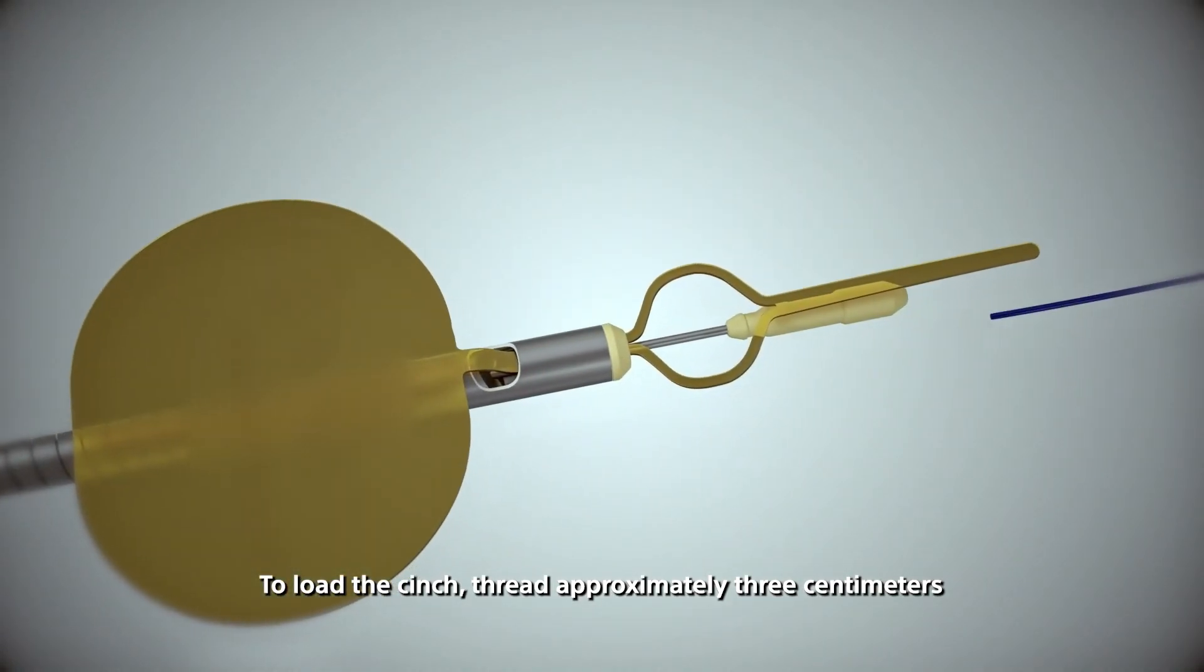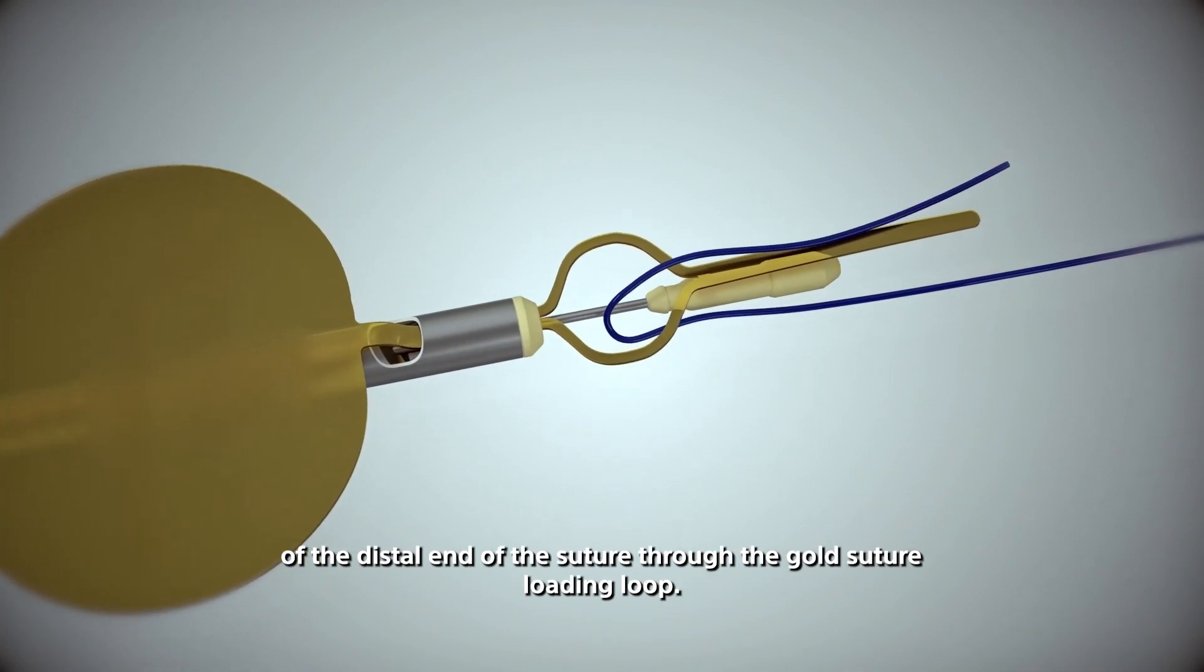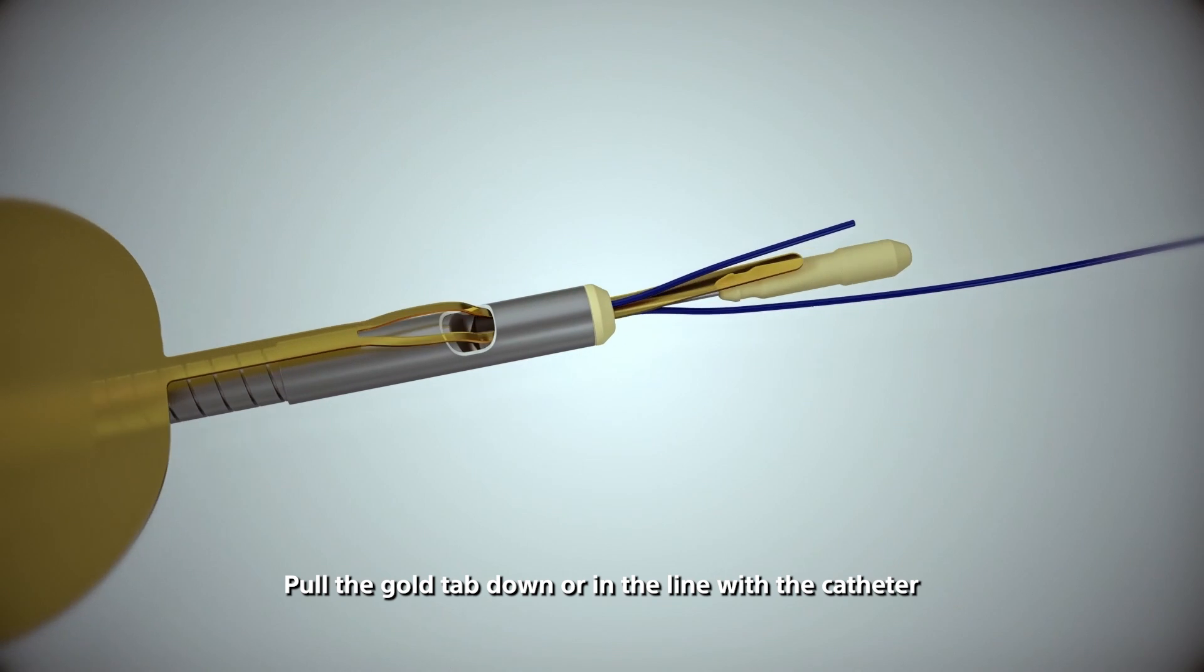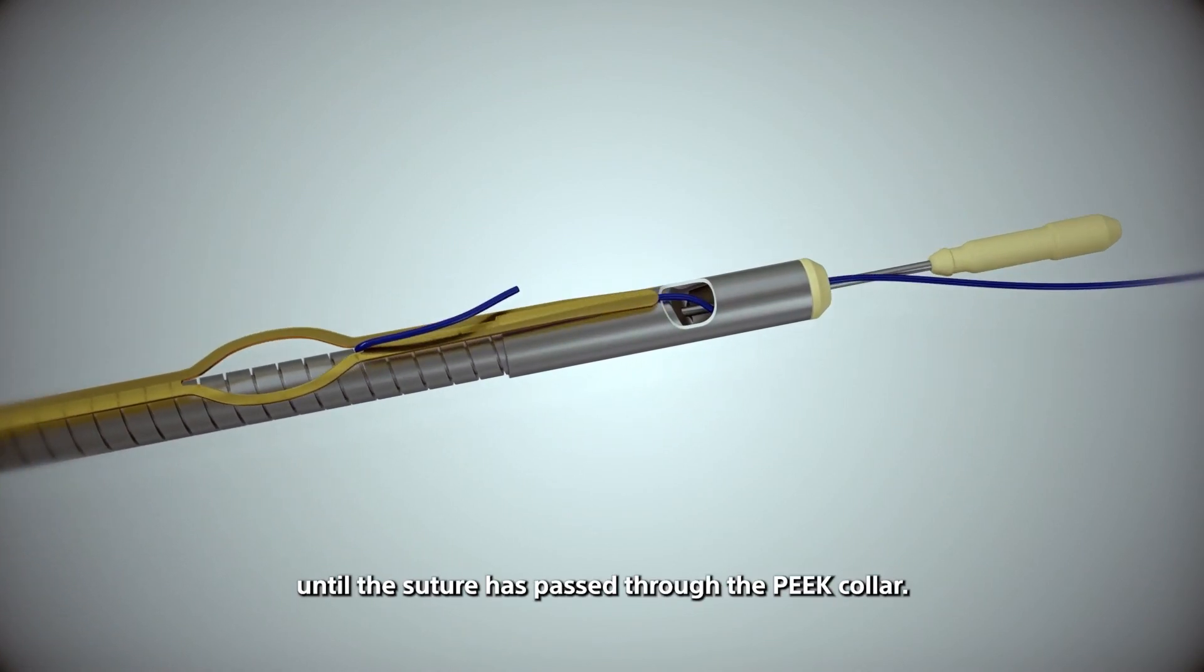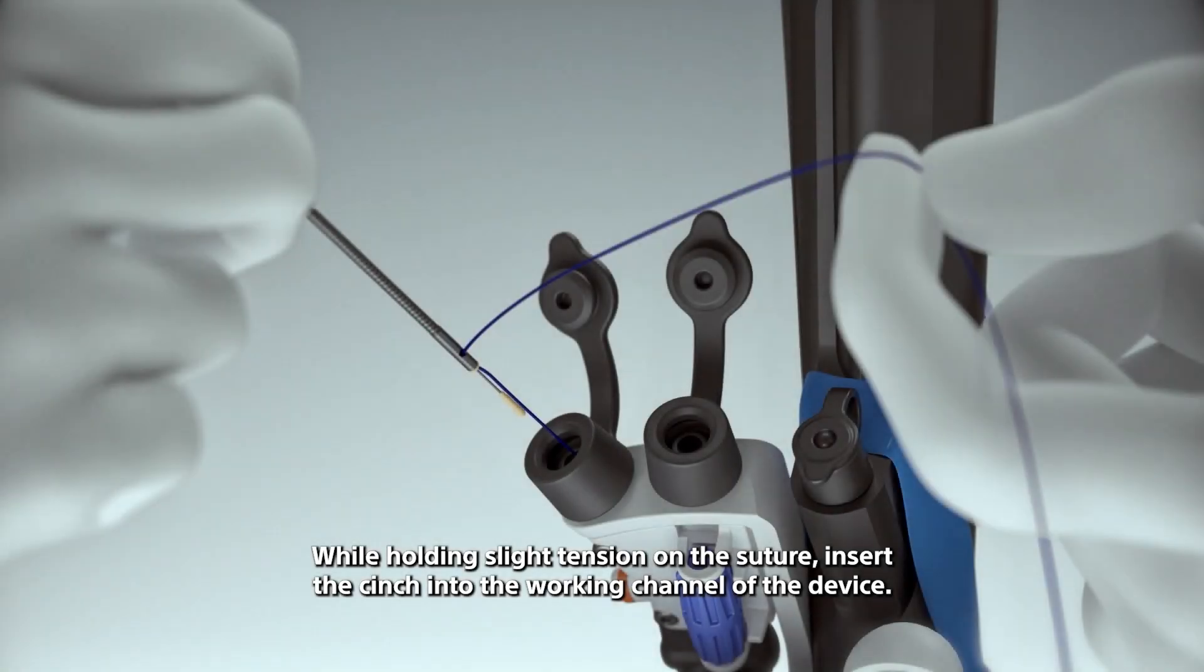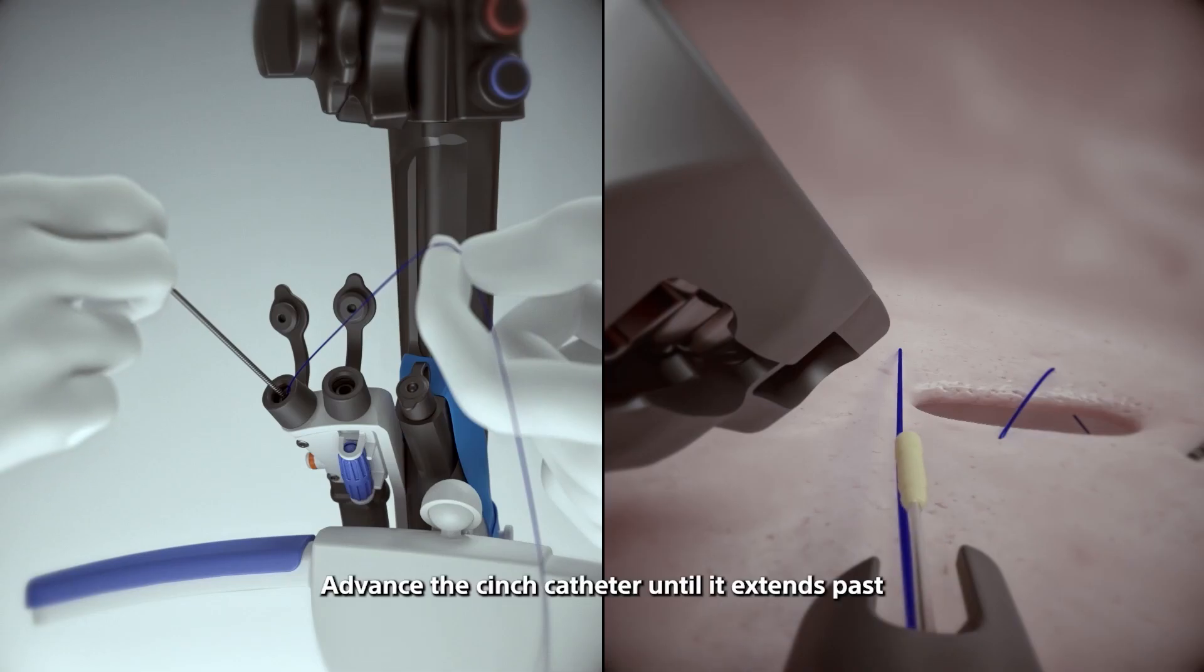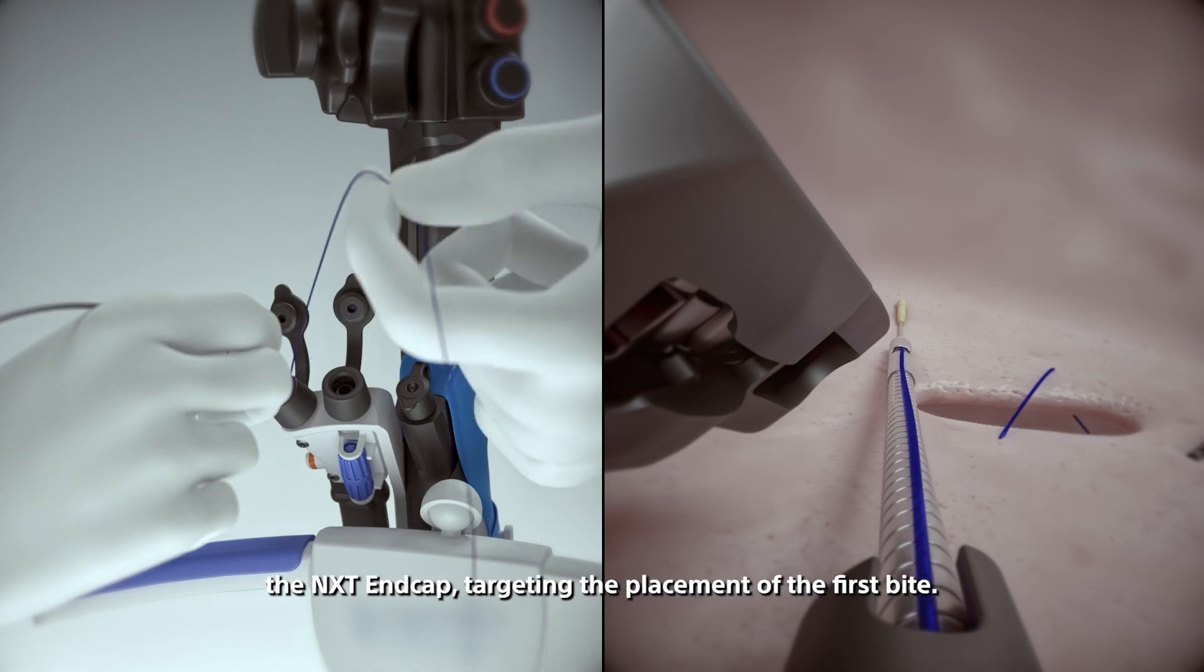To load the cinch, thread approximately three centimeters of the distal end of the suture through the gold suture loading loop. Pull the gold tab down or in line with the catheter until the suture has passed through the peak collar. While holding slight tension on the suture, insert the cinch into the working channel of the device. Advance the cinch catheter until it extends past the NXT end cap, targeting the placement of the first bite.